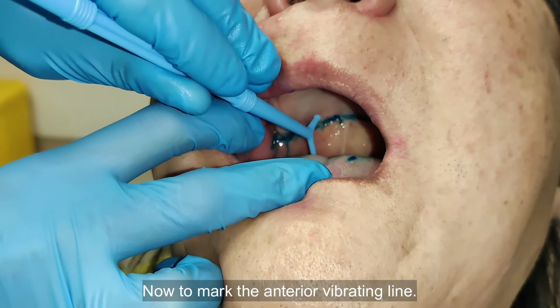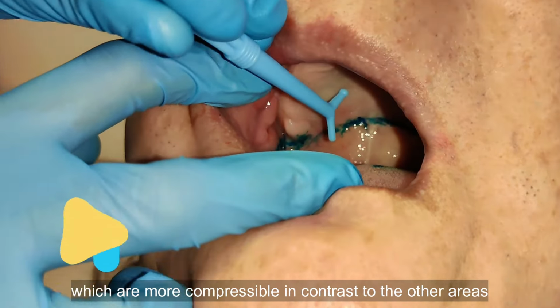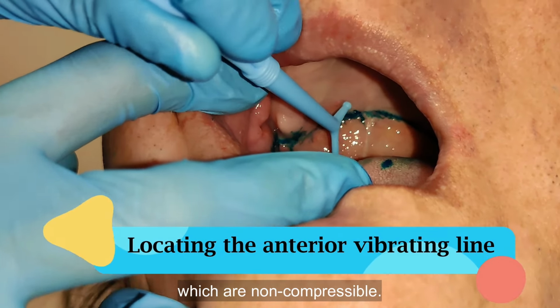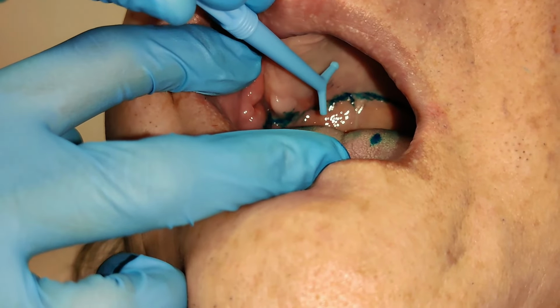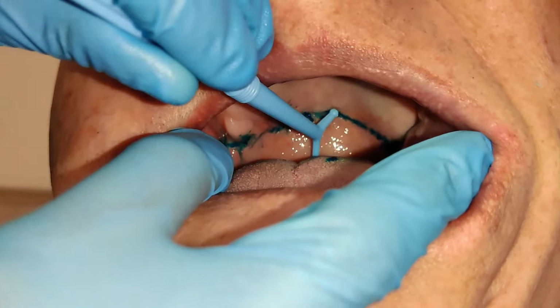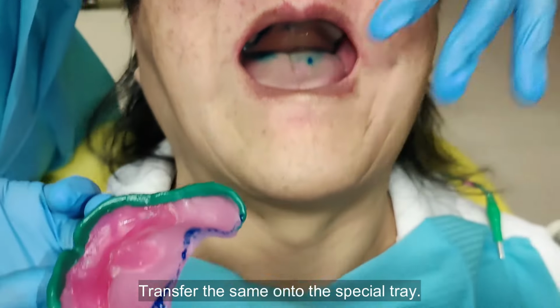Now to mark the anterior vibrating line, use the ball end of the T-burnisher to palpate the tissues which are more compressible in contrast to the other areas which are non-compressible. Repeat the same on the other side. Transfer the same onto the special tray.